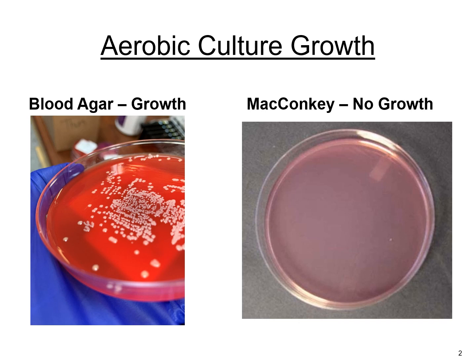So with a routine culture of a blood agar and MacConkey, then your gram-positive organisms will grow on the blood agar but not the MacConkey plate. So your MacConkey is selective and differential for your gram-negatives. So if we see that there's no growth on MacConkey, growth on blood agar, then we can probably assume that it's going to be a gram-positive organism.